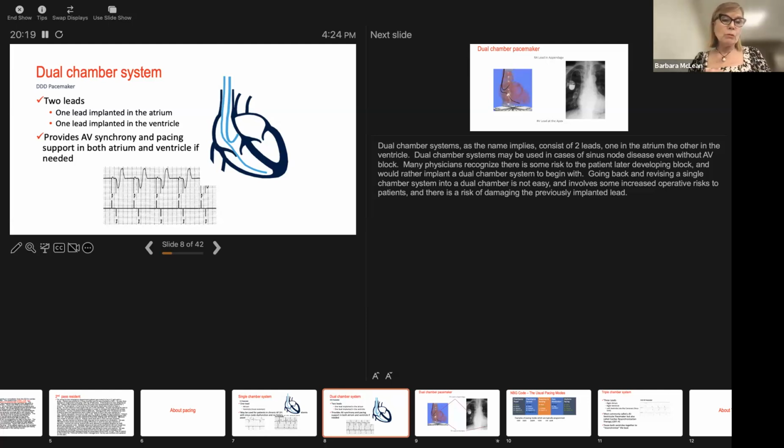For anybody who's got heart failure, I want that interval from atrial spike to ventricular spike to be about 0.20 to allow time for the atria to contract and fill the ventricle. Okay, so remember, I can manipulate that when it's a temporary pacemaker.